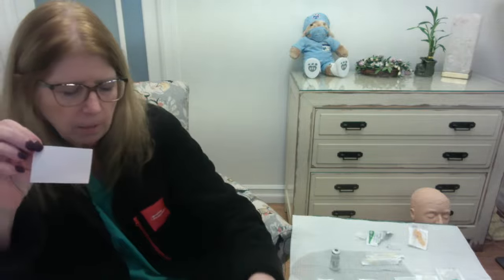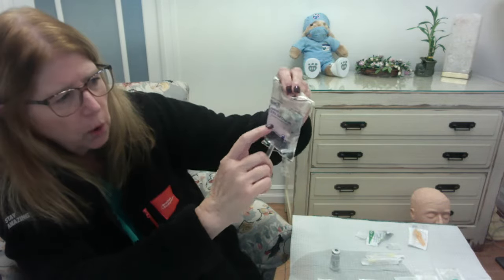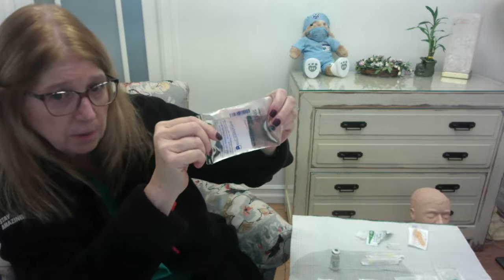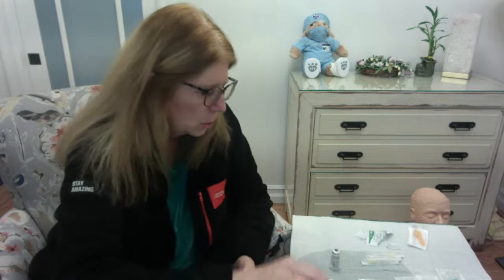Right? I'm going to take this label and I'm going to put this on the back of the bag, because I do not want to cover the barcode on the front of the bag, because, you know, we use barcode scanning in the hospital. You're going to need to scan that barcode, okay? So that is our drawing up out of ampules, vials, and then the reconstitution process. And again, you are going to practice this in lab, okay?